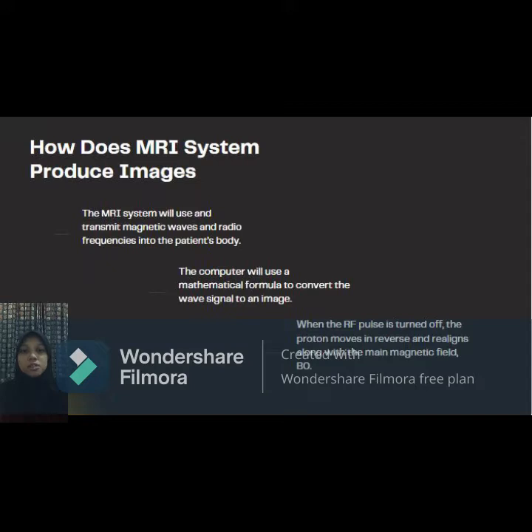The patient should lie on the table that will move into the MRI machine for about 20 minutes for a spinal examination and about 30 minutes for the legs, brain, and all other types of examination. Usually, the space for the table to move into the machine is rather narrow and compact. However, new technology has allowed the space in the MRI machine to become more spacious and make it easier for patients to be more comfortable during examination.